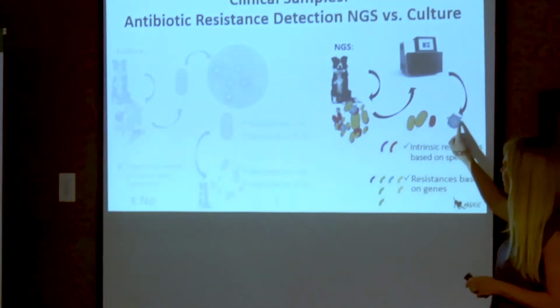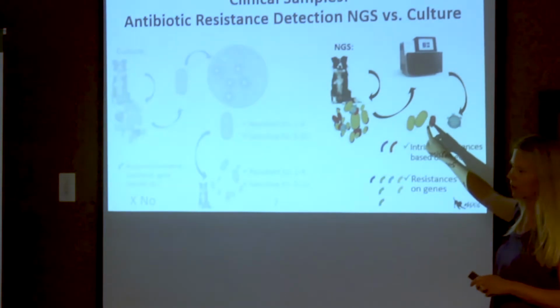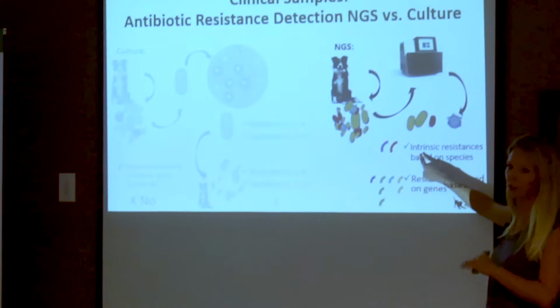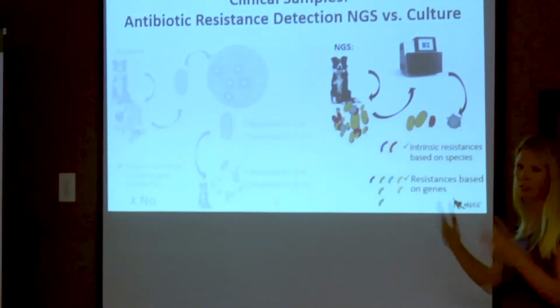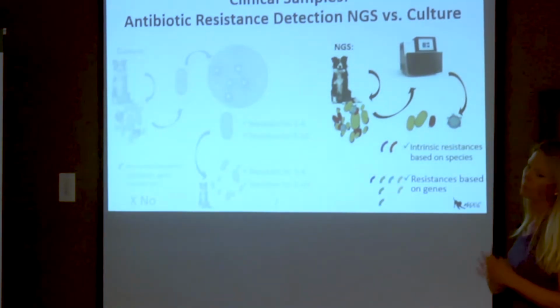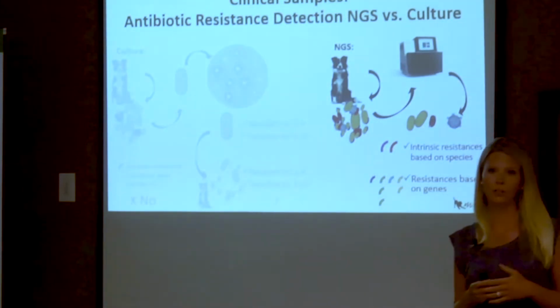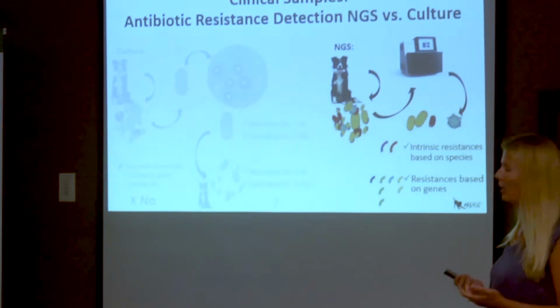And we know who is there, so we can go back to databases and predict the intrinsic resistance, because this is all published data that you can just pull from other publications, and it's reliable. It's being updated constantly because so many groups are working on this worldwide.